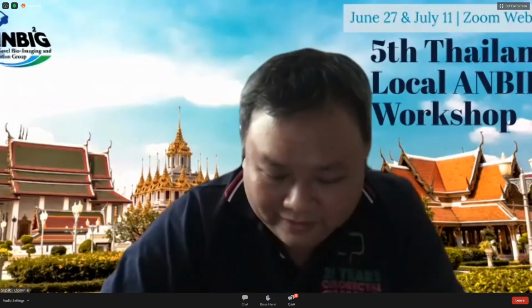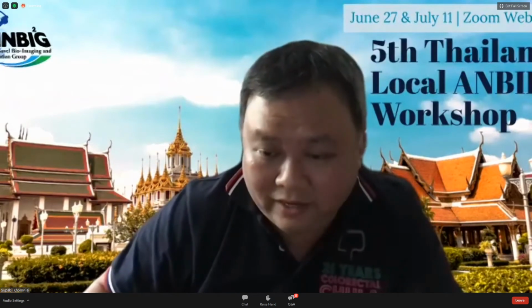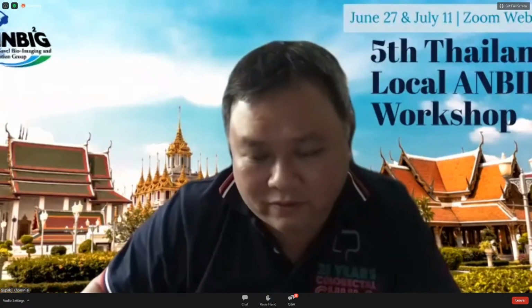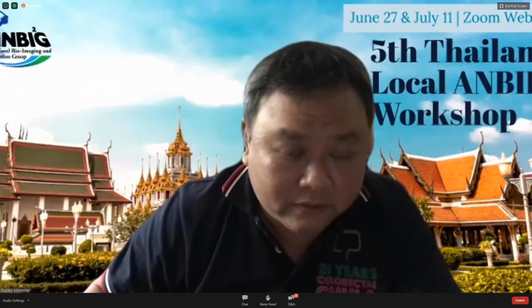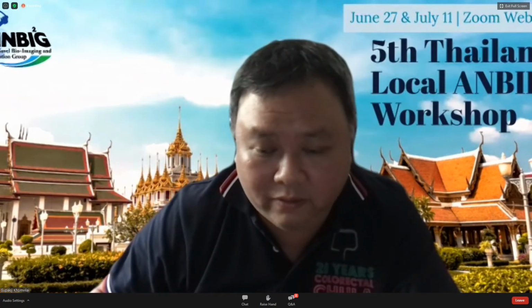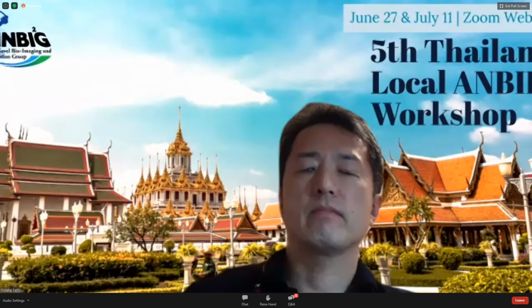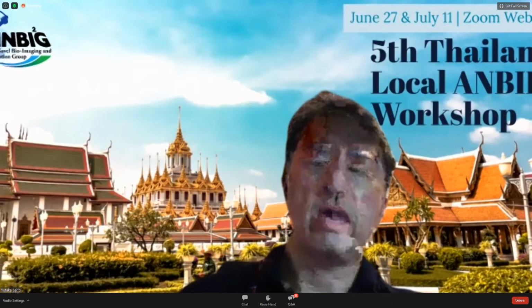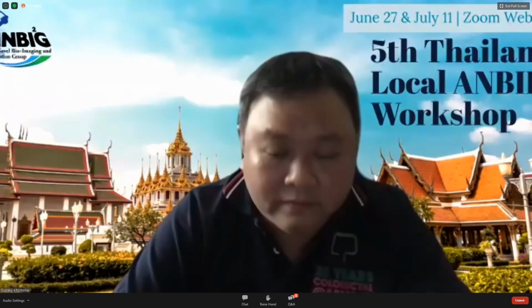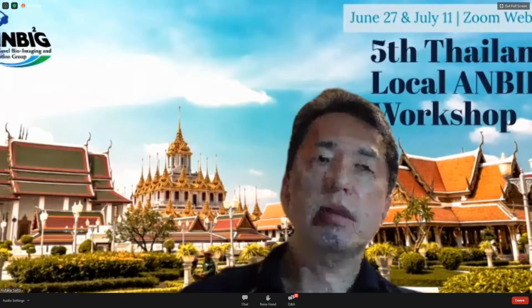Yes, thank you. So another question from the audience, they're asking about the energy mode for the coagulation during the ESD procedure to coagulate the thick vessel. What is your recommendation, Professor Yutaka? So for the pre-coagulation of the thick vessel, I follow Professor Toyonaga's setting, so-called 110. The 110 using the Vio 300D.